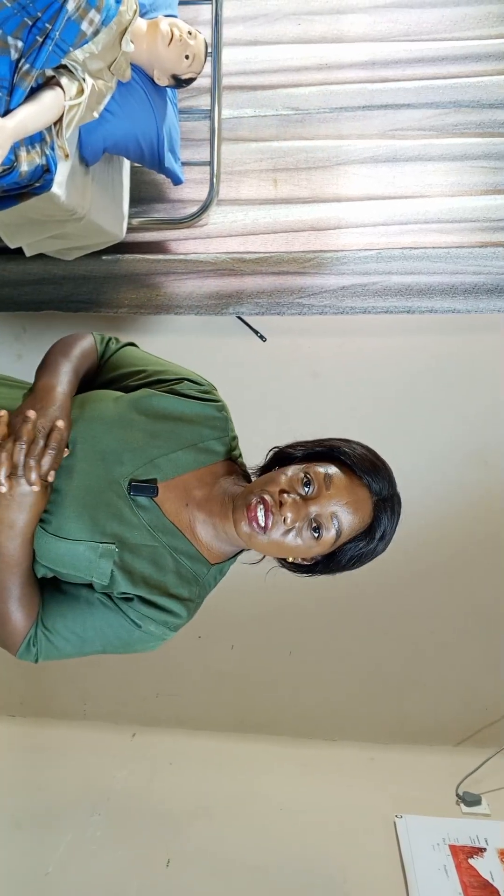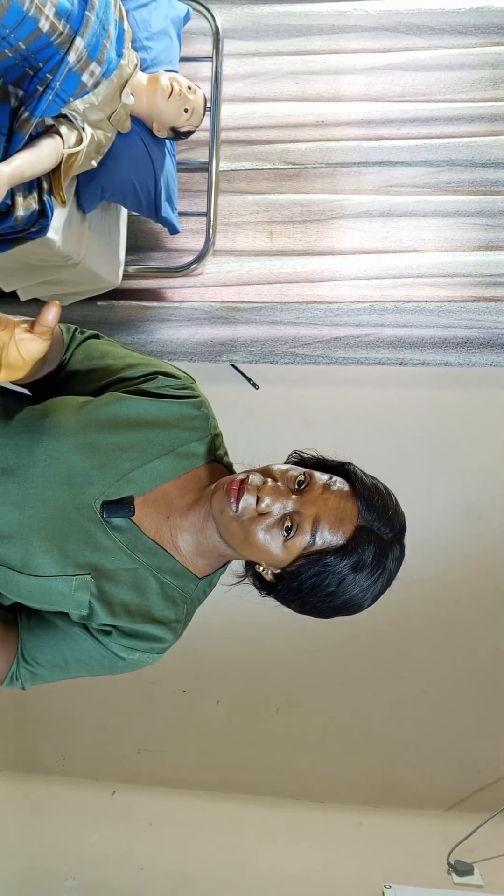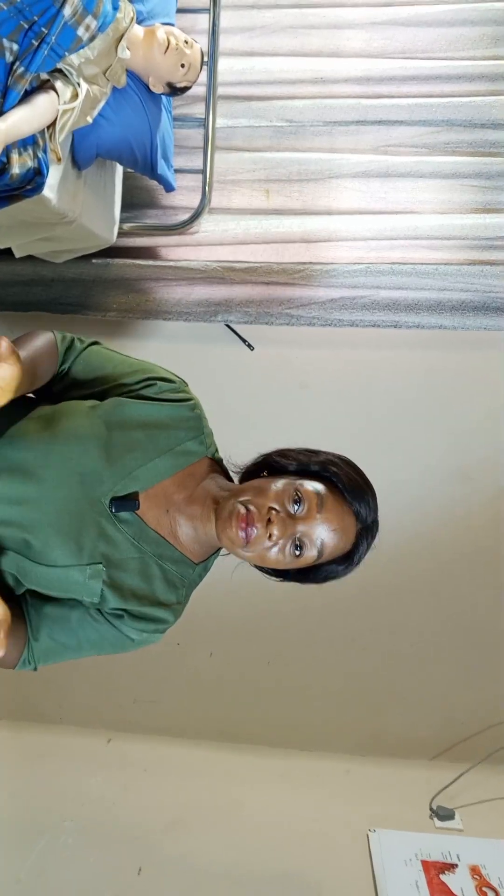So when you are about to perform this kind of procedure — be it during nursing exams or clinical practice — please kindly identify your patient first. Your identification of the patient is very important so that you know the procedure you are carrying out is on the right patient. You carry your folder or check on the system, then go and ask the patient their full name and date of birth.